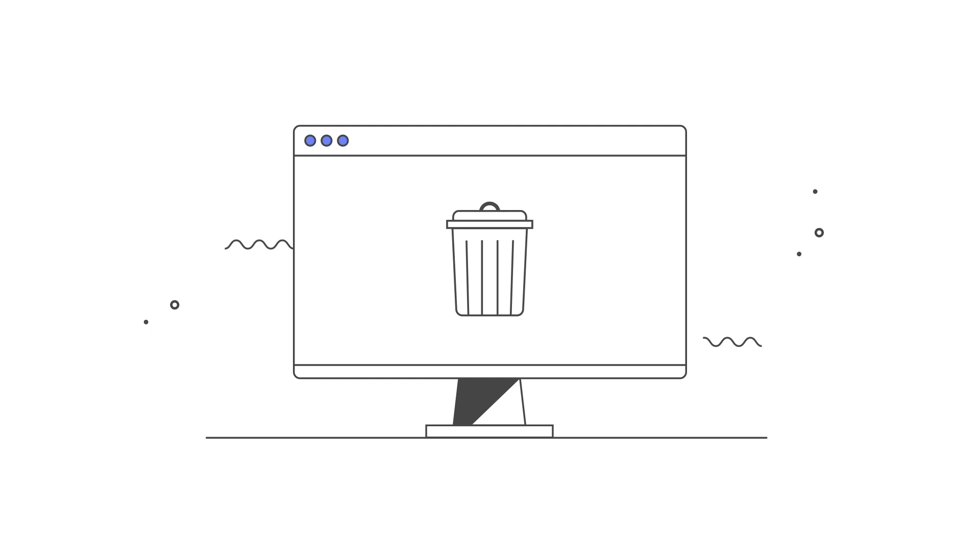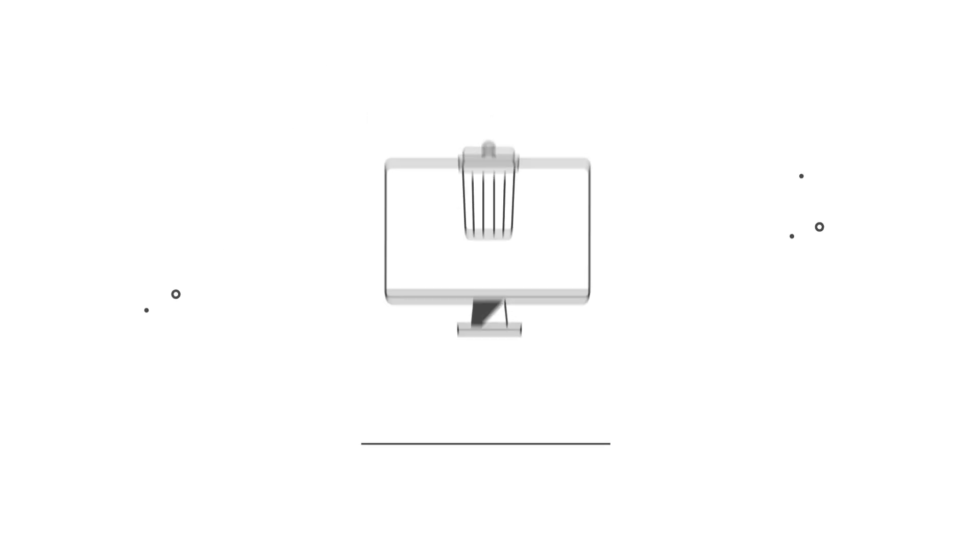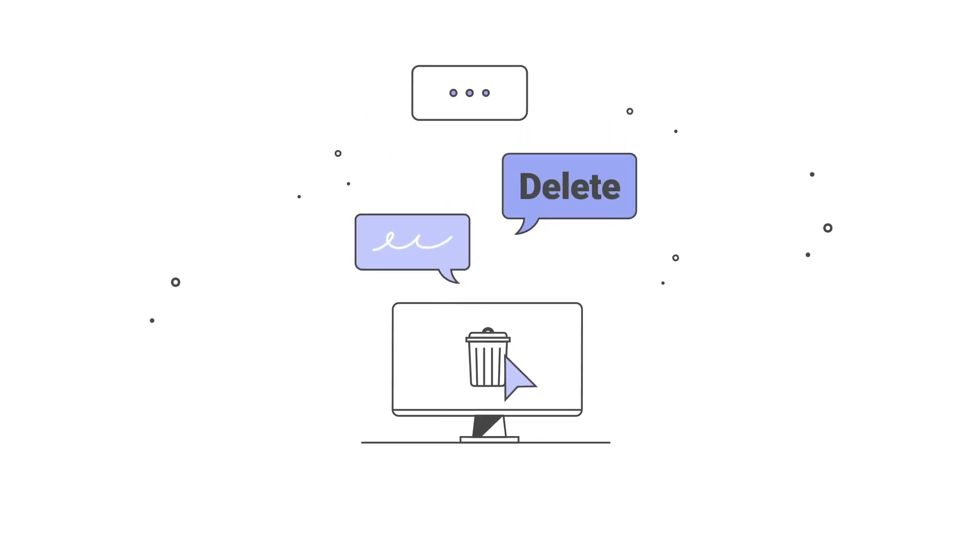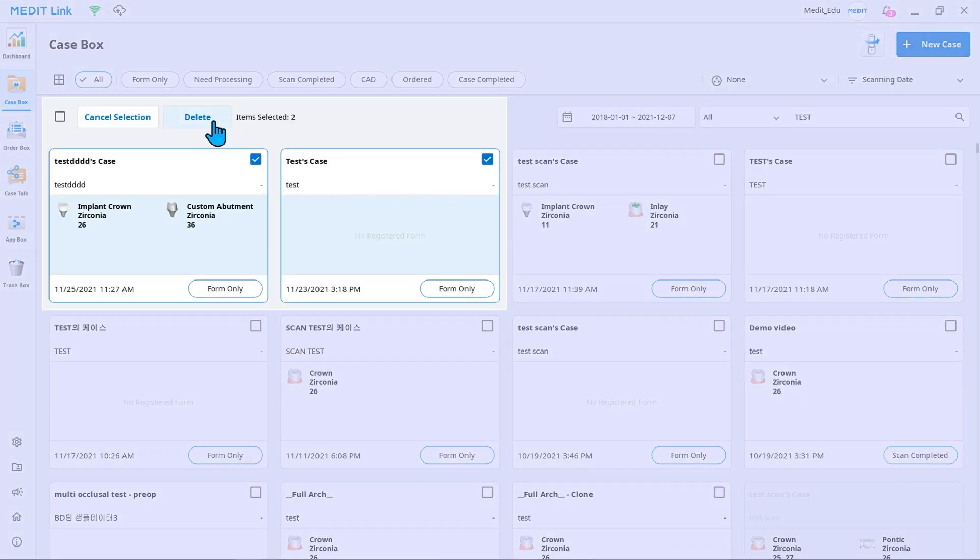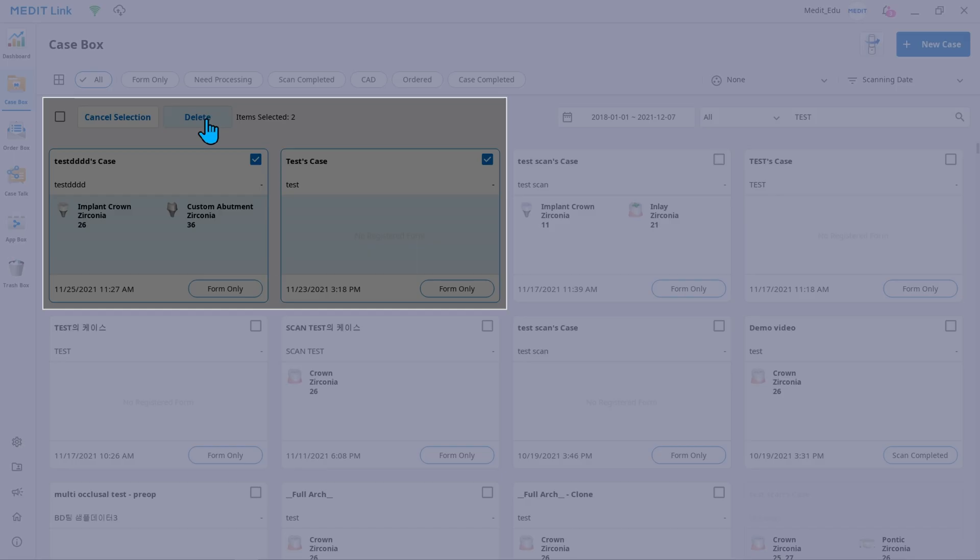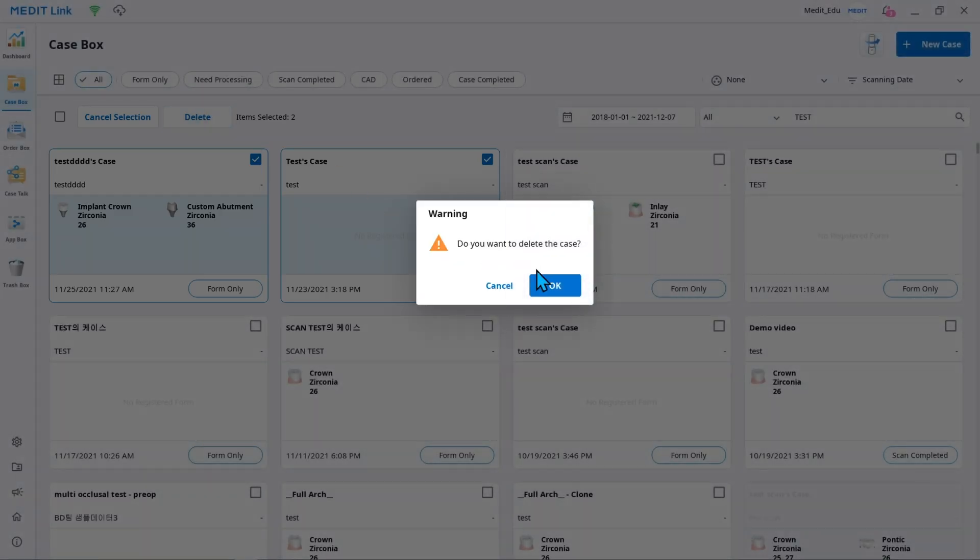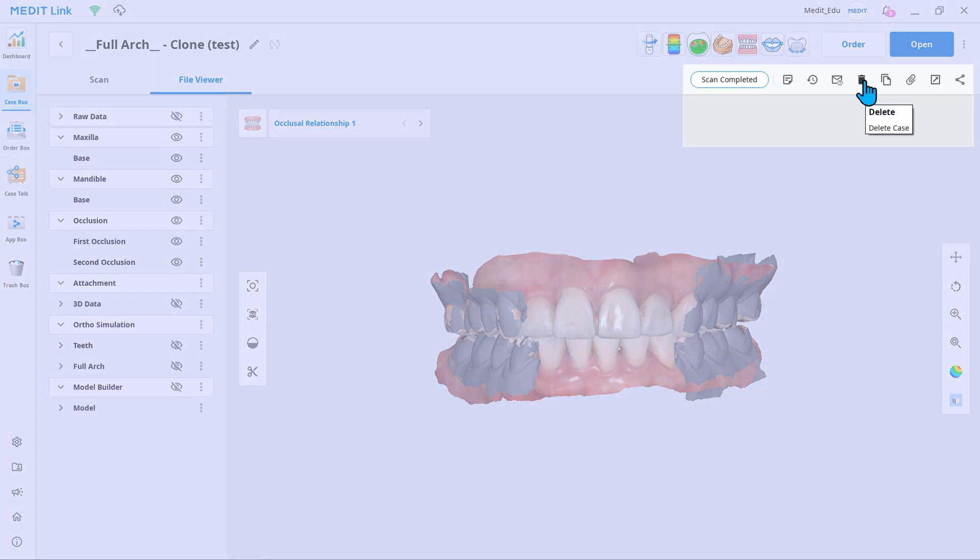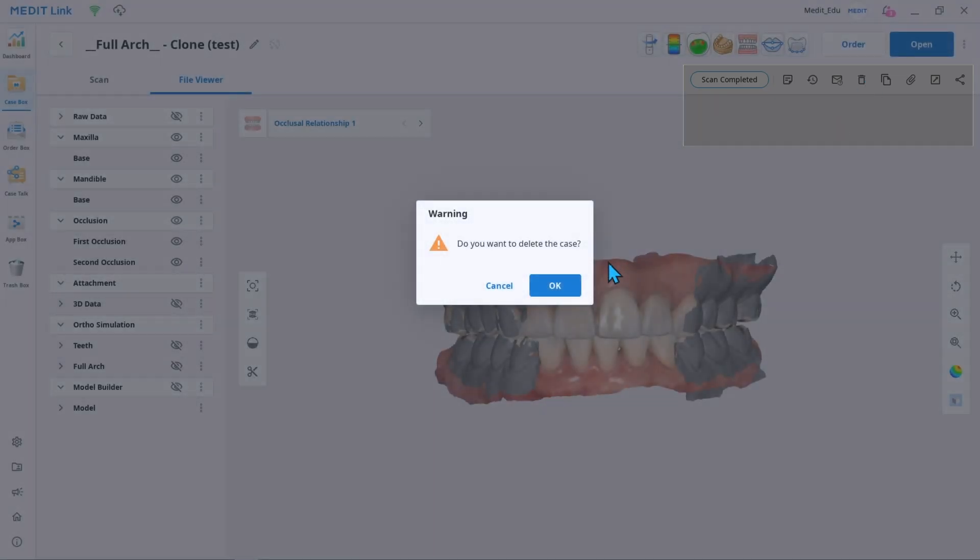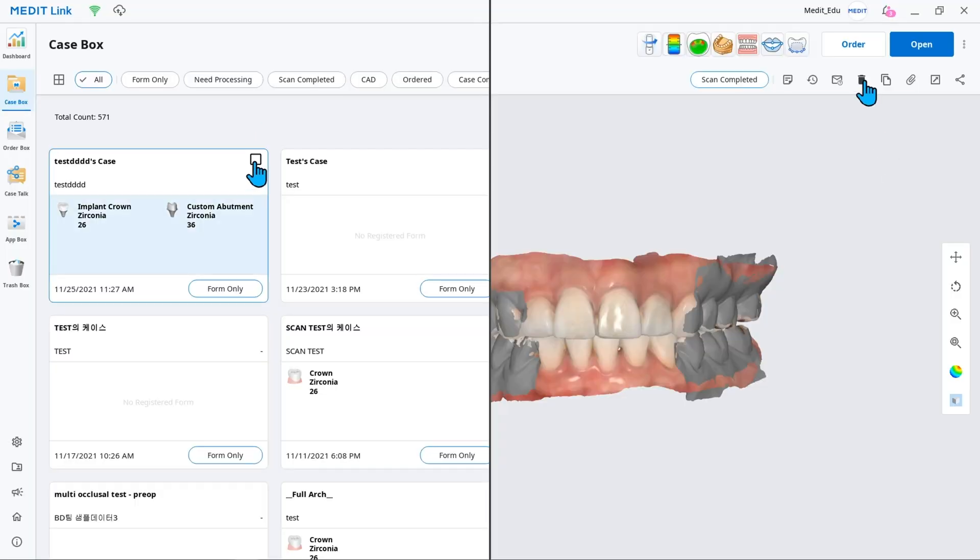There are three ways to clean up files in Medit Link. The first one is to delete cases from the case box. Select all the cases you don't need and click delete. The second one is to delete a single case file when it is opened. Just find the delete icon at the top.